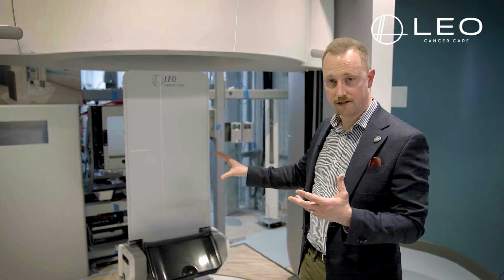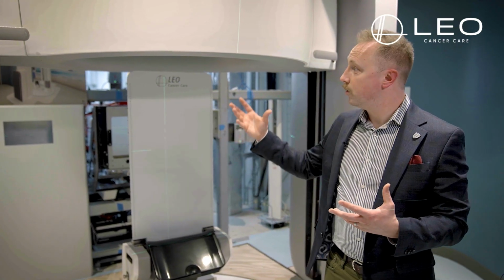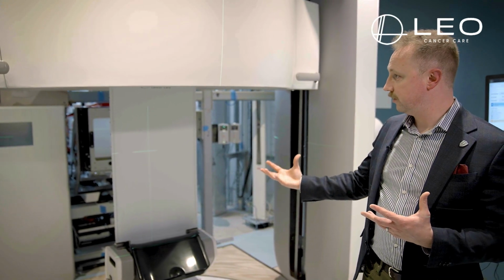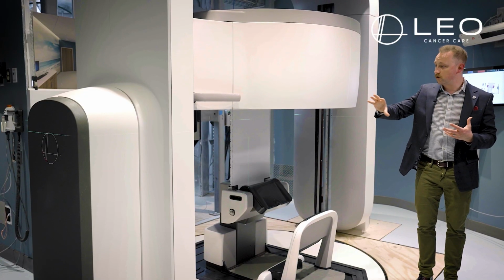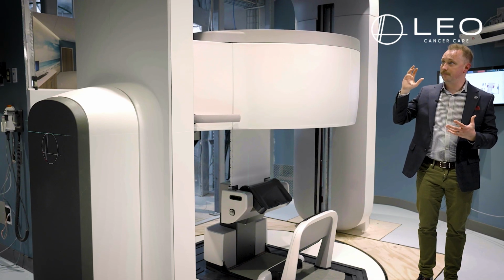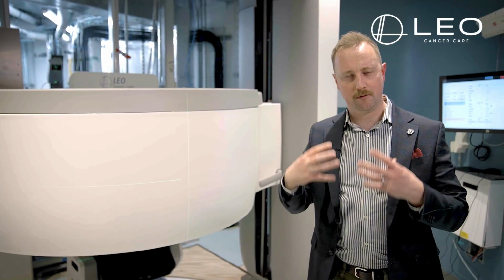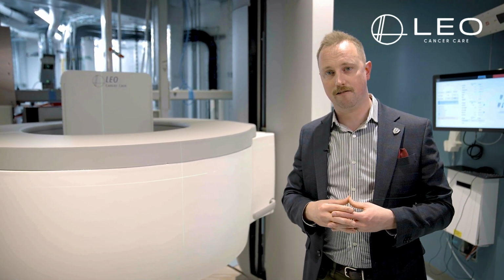Once we have the patient set up in their comfortable, optimized posture, we bring the CT ring down around the patient, noting that the angle of these arms on the side is always parallel to the direction of the backrest. So we're always imaging with the same imaging planes that we typically see in radiation therapy today.